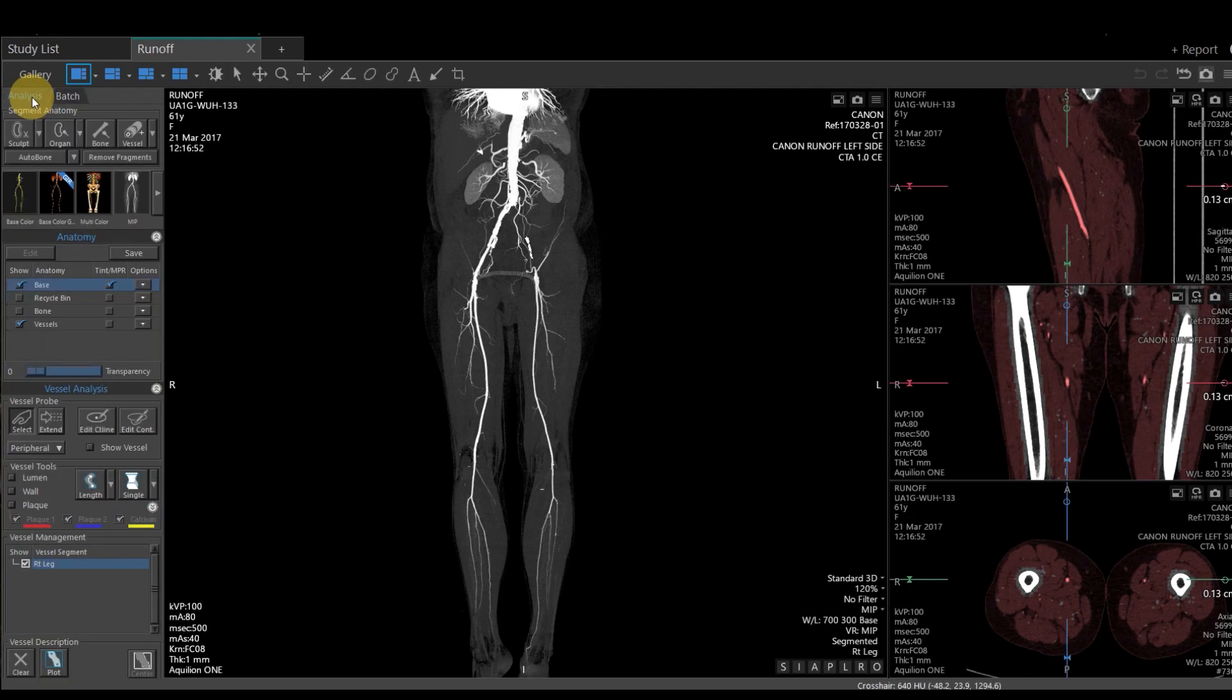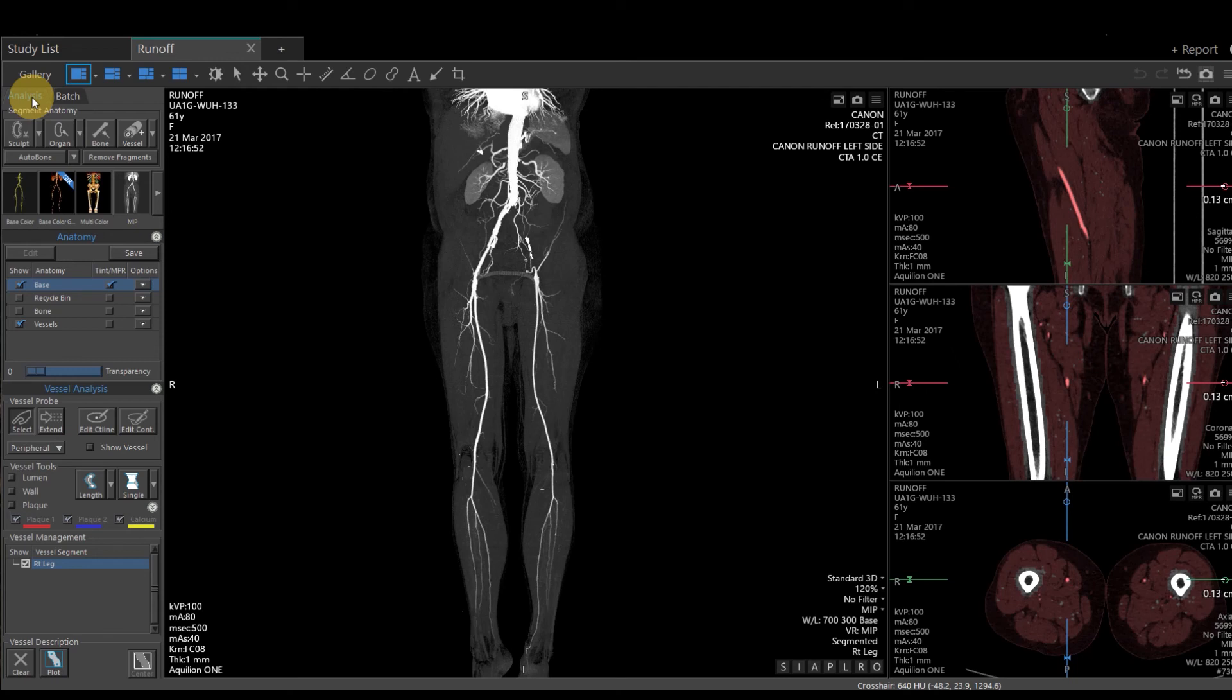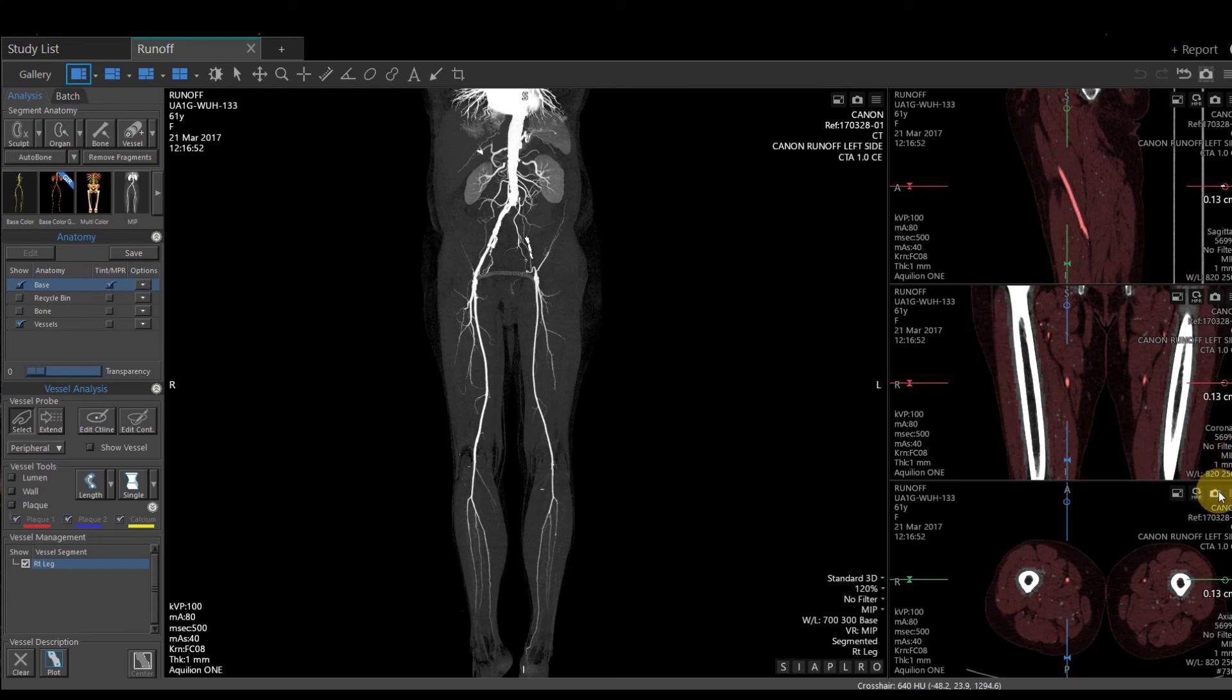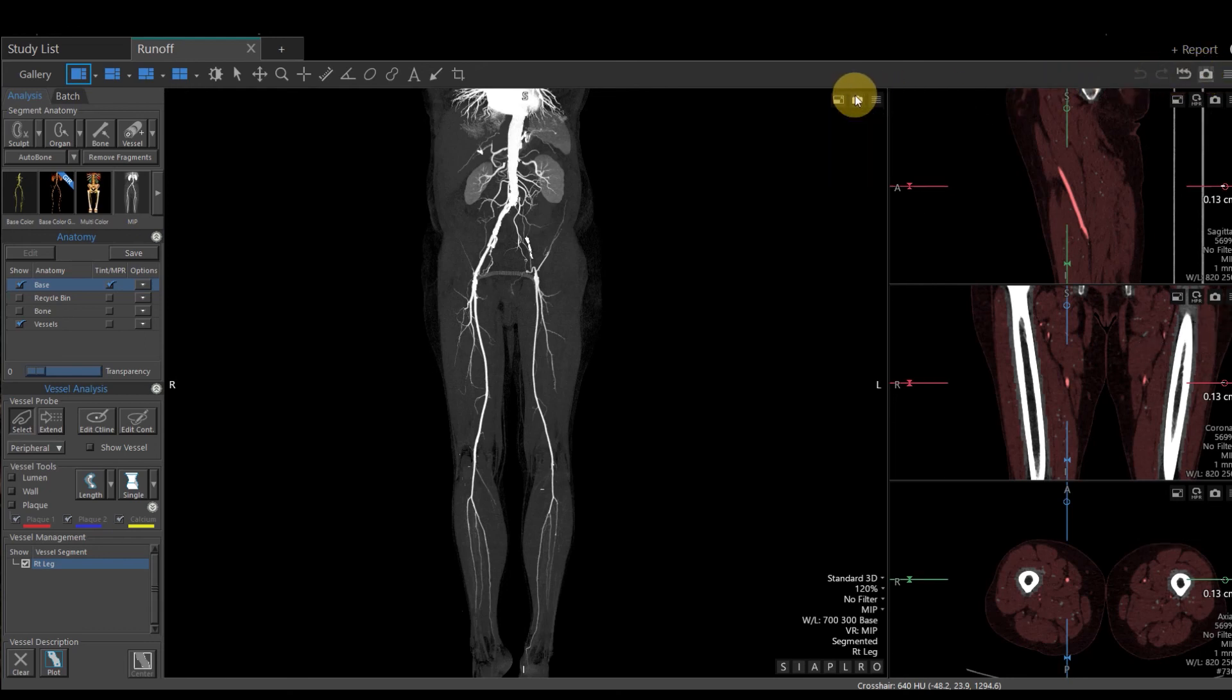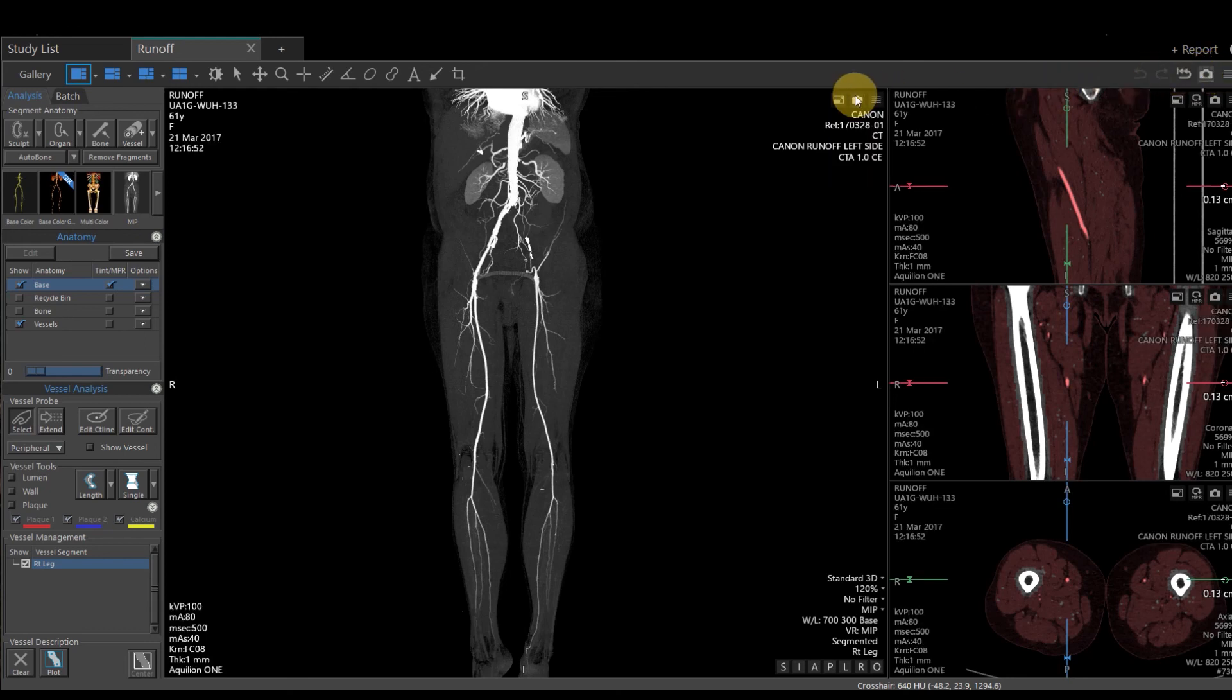I'm going to come back to Analysis. Anytime I do a workflow, I always like to take a snapshot to save my work. Or if you find something you want to document, each individual viewport has its own camera. That will take that specific viewport. Or you have a camera on the very top toolbar that will save the entire screen. I'm going to take a picture, and I'm going to X out so I can send my images.